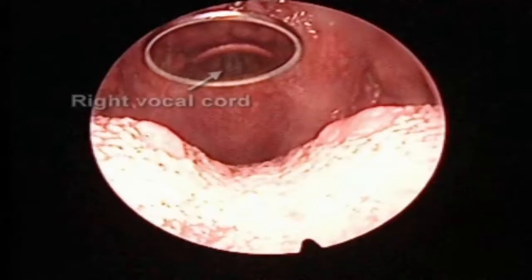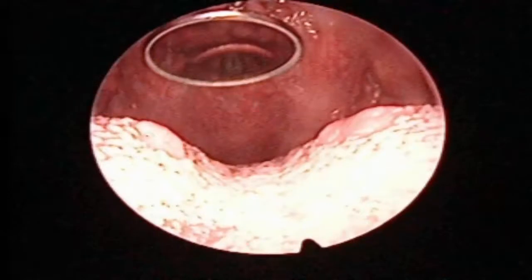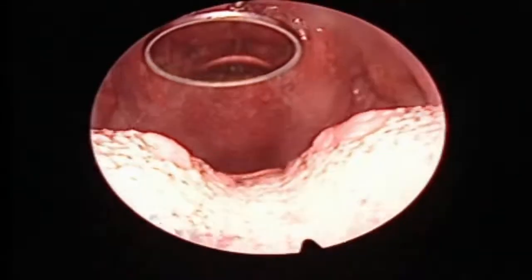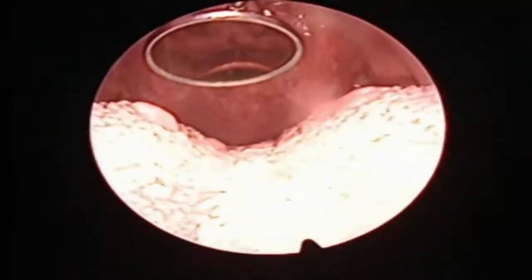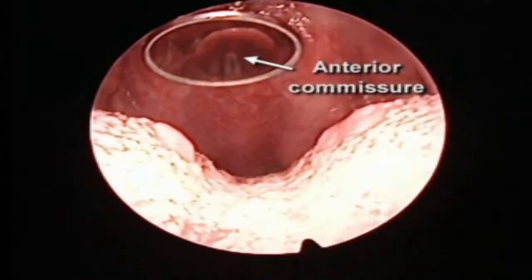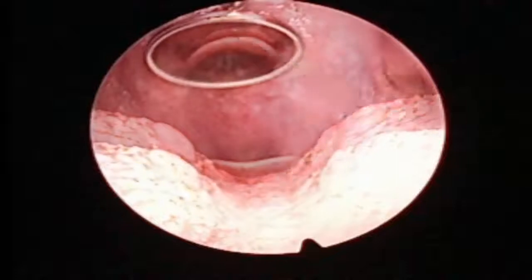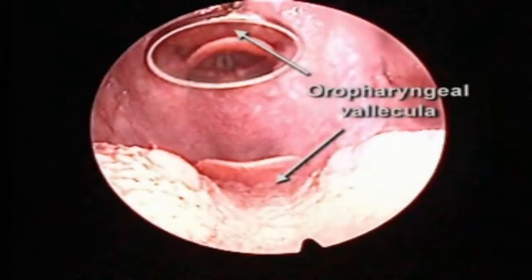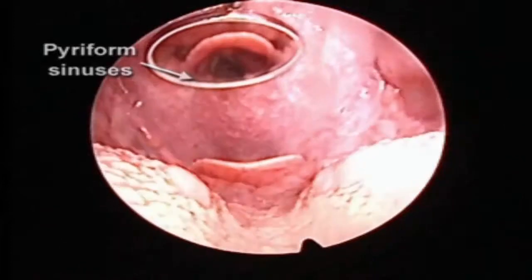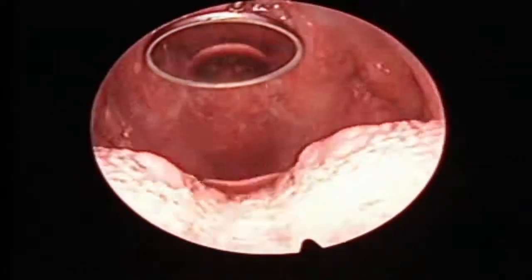In other words, the right vocal cord appears on the left side of the examiner's view on the mirror, and vice versa. The anterior aspect of the larynx can be seen by asking the patients to say "E" in an even higher register. This fully visualizes the anterior commissure. The oropharyngeal vallecula and the piriform sinuses in the hypopharynx are also visualized and should be inspected for symmetry.